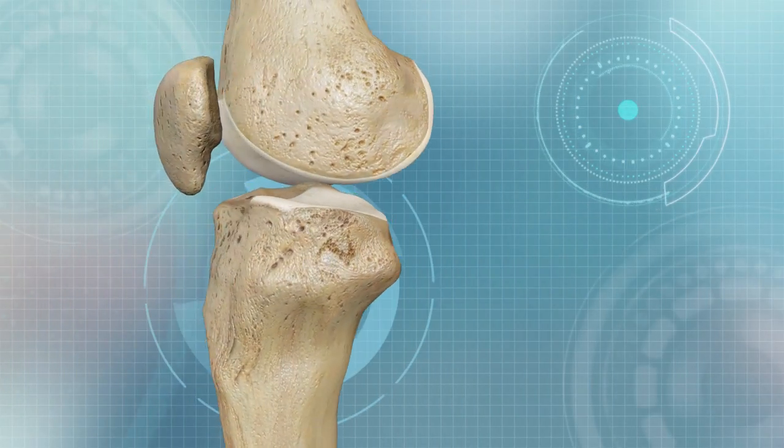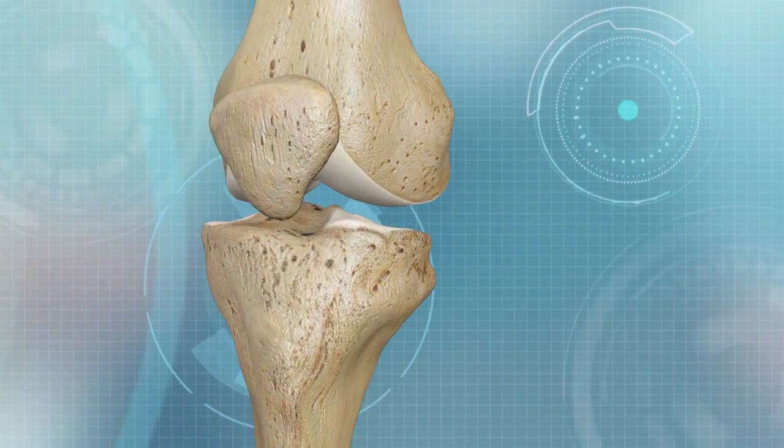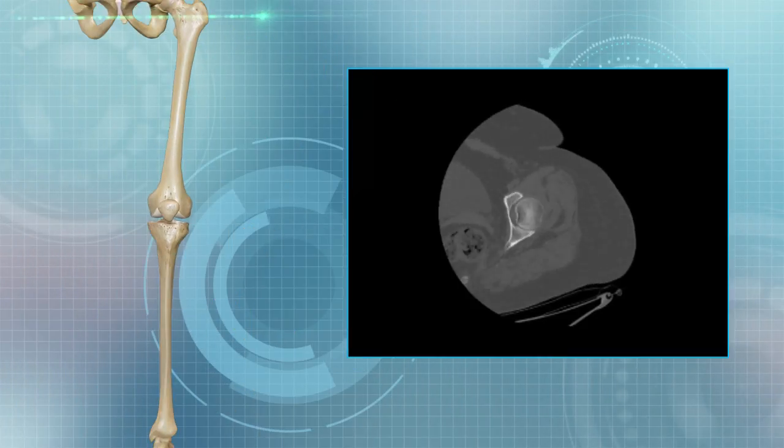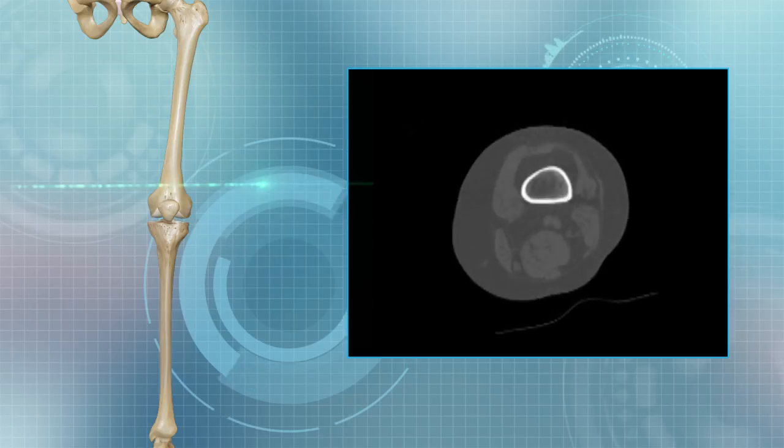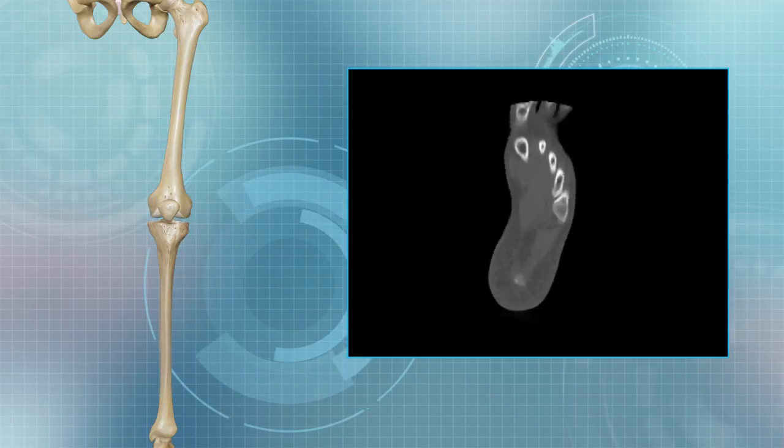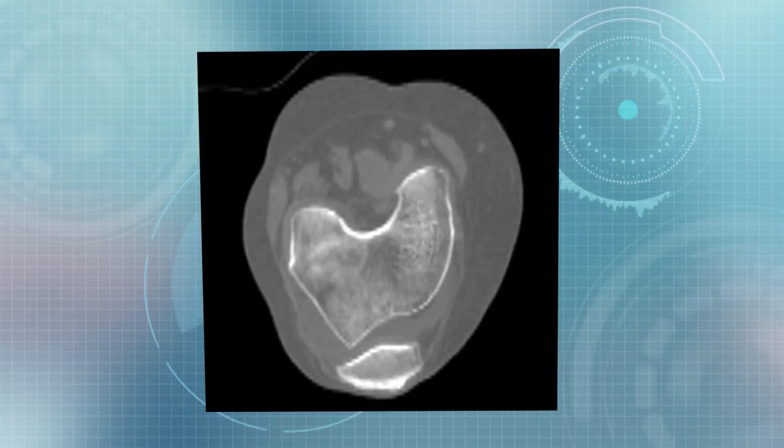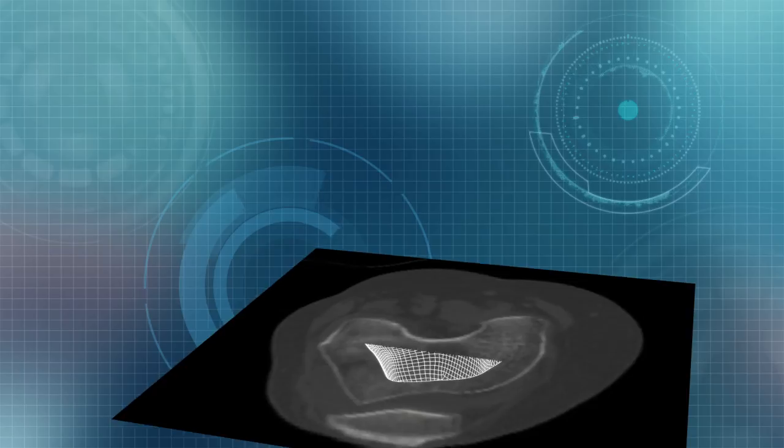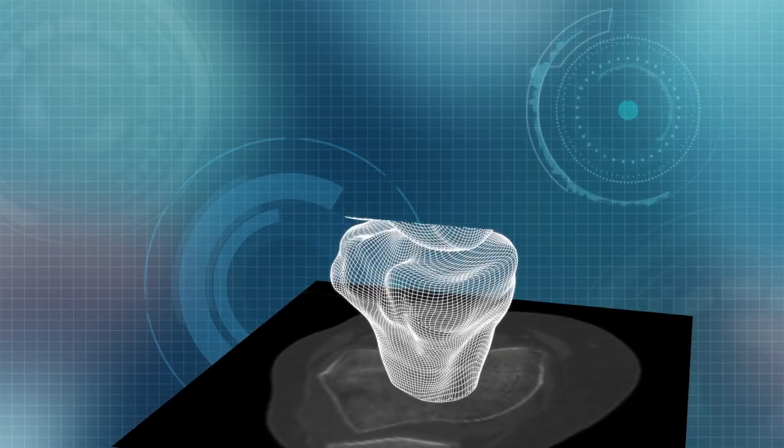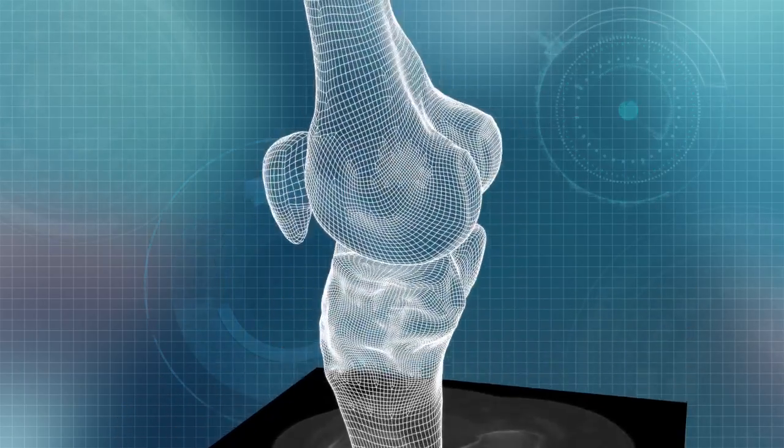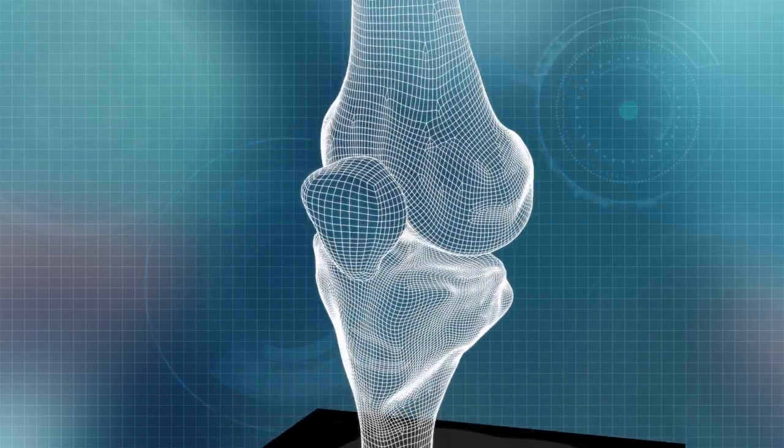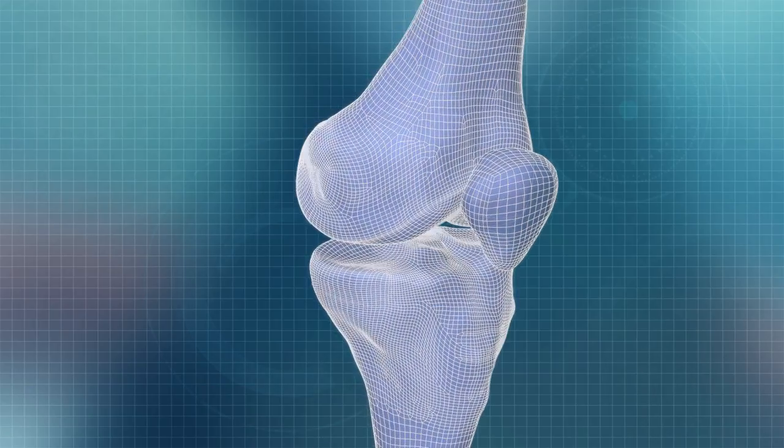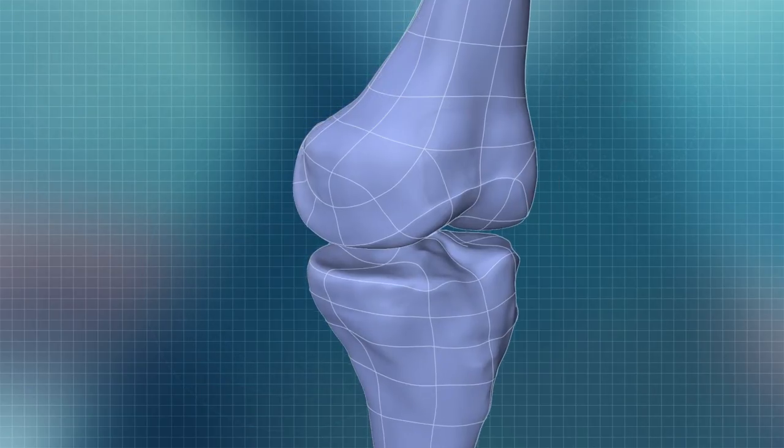The ConforMIS process starts with a patient CT scan through the hip, the affected knee, and ankle. The proprietary iFit software converts the two-dimensional CT data into a three-dimensional model that replicates the patient's unique anatomical bone geometry.